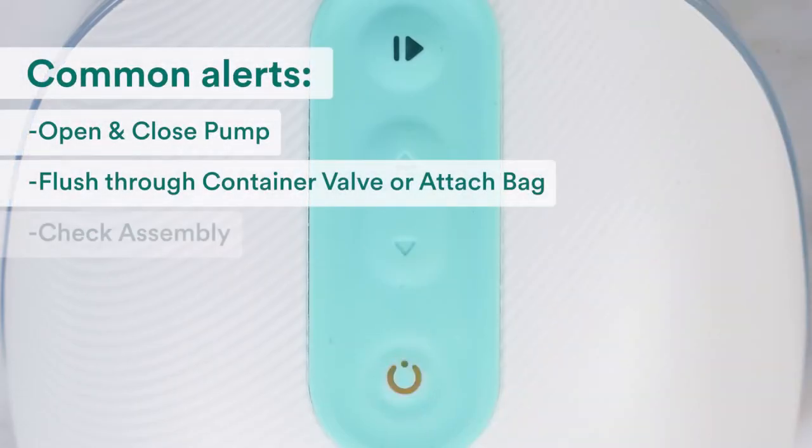See an orange blinking light on your pump? Open the Willow app to review any alerts, and in this video, we'll walk you through troubleshooting the most common issues.